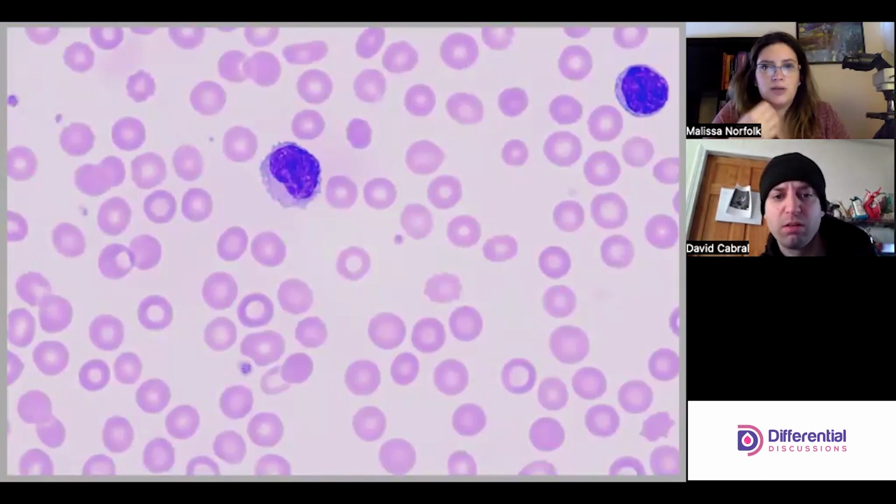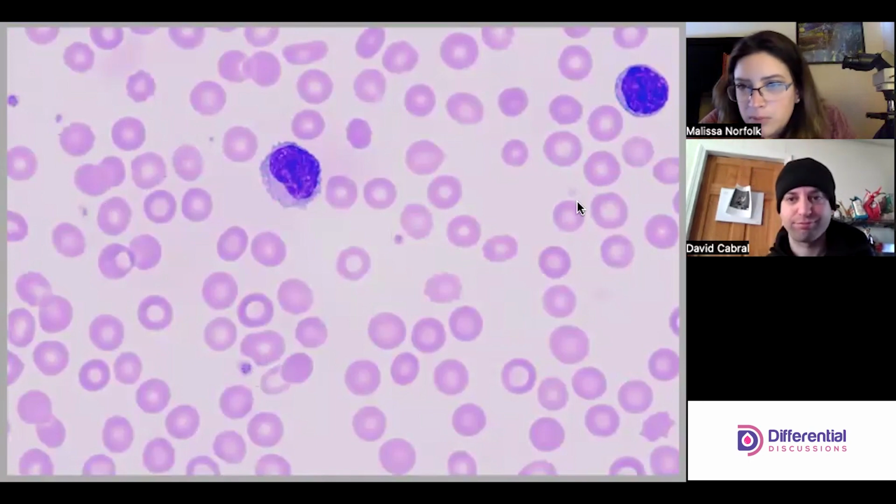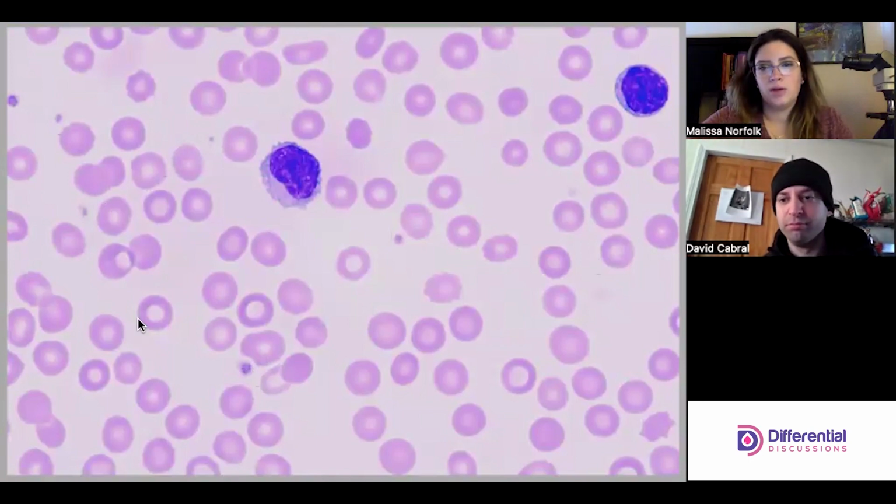The other thing to point out is that there's a decent number of platelets. There's one here. And so why did you note that? Very good. I'm glad you brought that up. There's a bunch of them. And I brought that up because it's chronic, right?